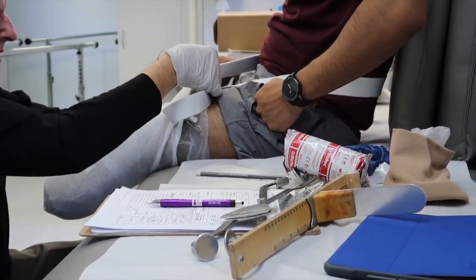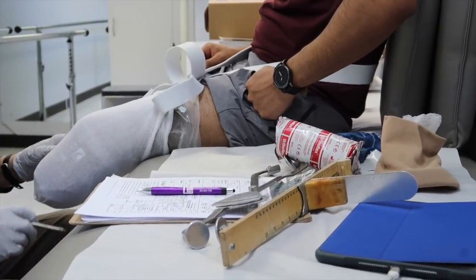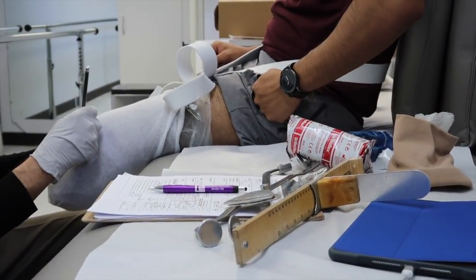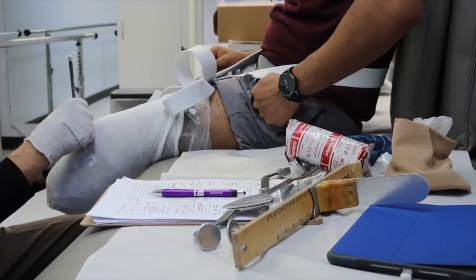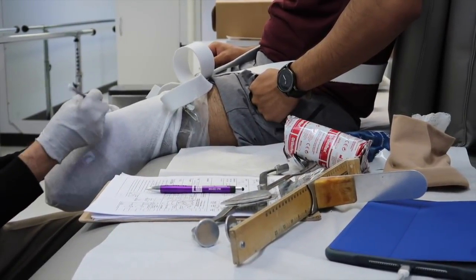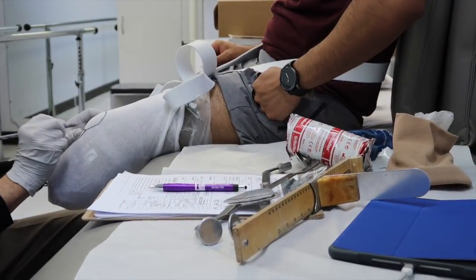Everything was pretty exciting. It's pretty interesting how technology has grown so much for people to be able to create legs for amputees like myself. Back when he first started, he was using wooden legs, so for me to actually be able to use more of the newest technology is quite exciting.